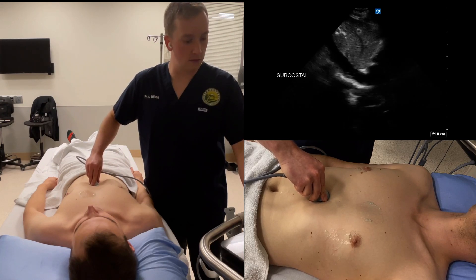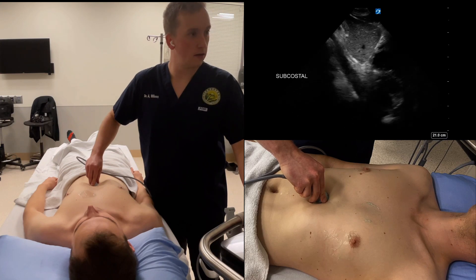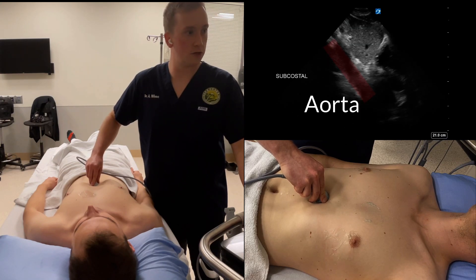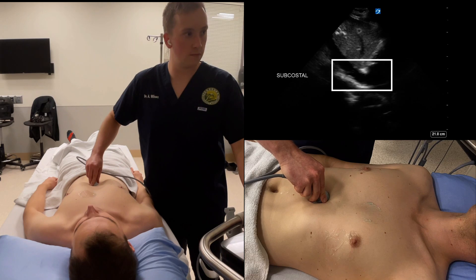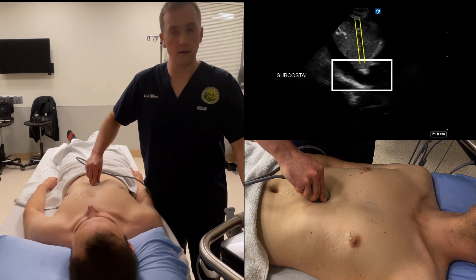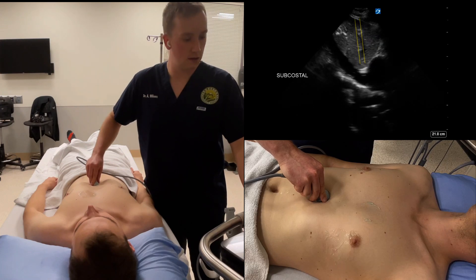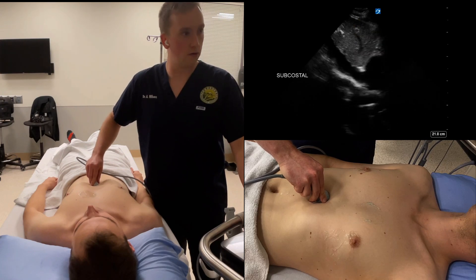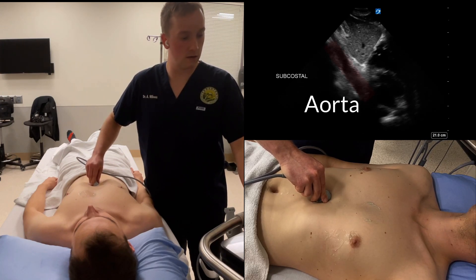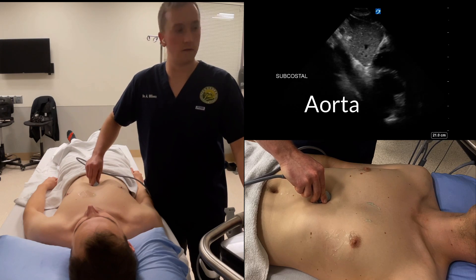Sometimes the IVC can be confused with the aorta. Some distinguishing features: the IVC will have a junction with the right atrium, there will be a hepatic vein joining the IVC, and the IVC is encased with hepatic tissue. The aorta doesn't have these junctions and is encased in mixed-density hyperechoic fat.